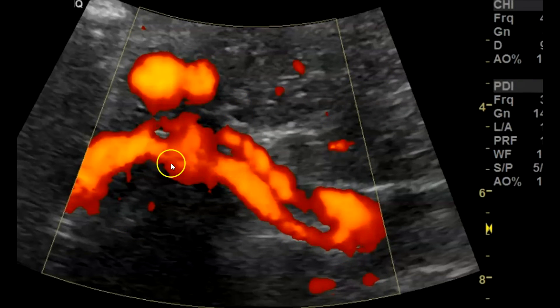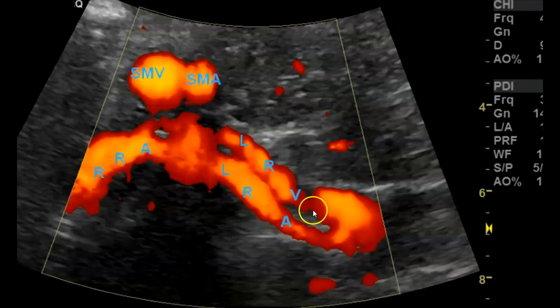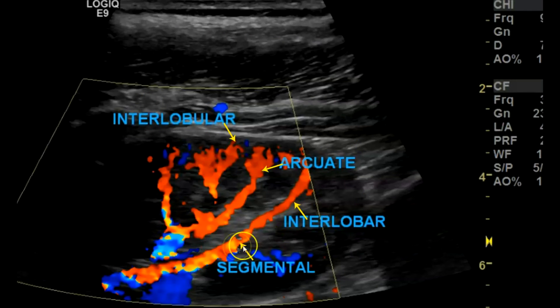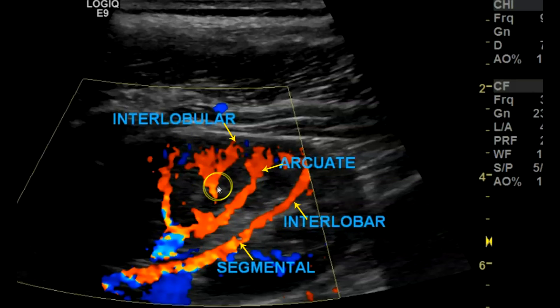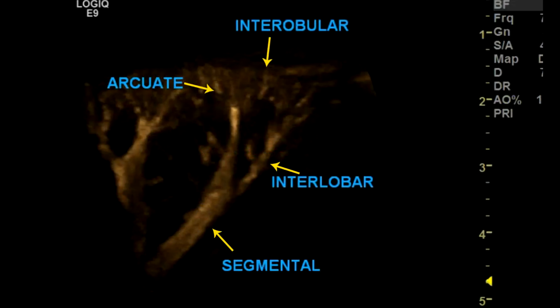Here's the same with power Doppler — right renal artery, left renal artery labeled. Remember the left renal vein usually goes in between the aorta and SMA — very important for ruling out nutcracker syndrome. Here's the labeling of the intrarenal arteries: segmental, interlobar, arcuate, and then interlobular at the very end, shown with B-flow.